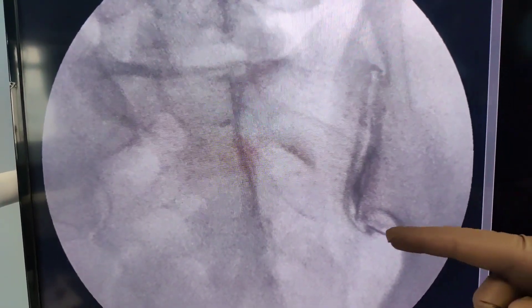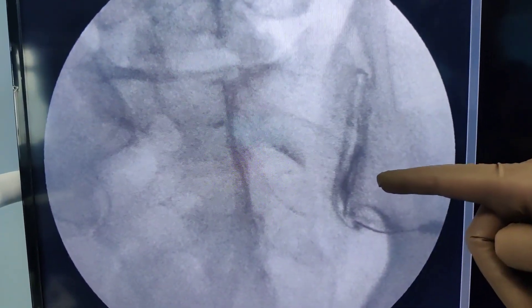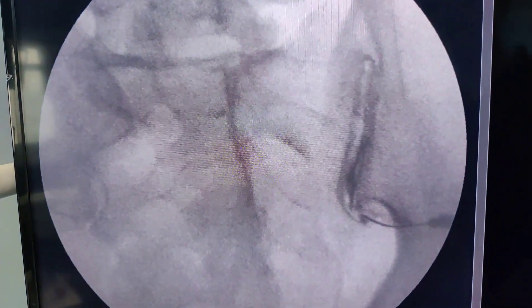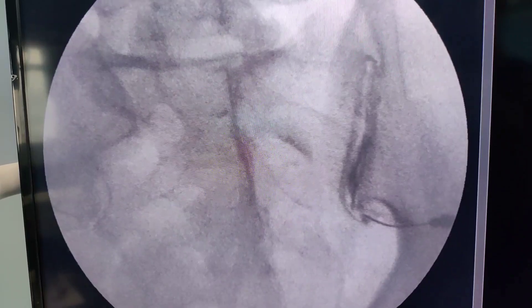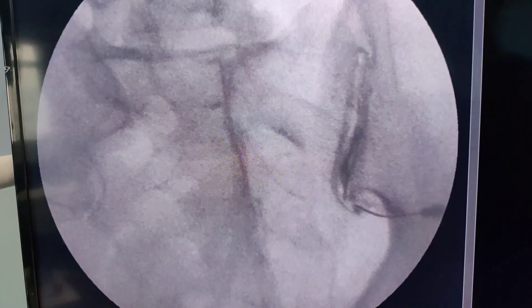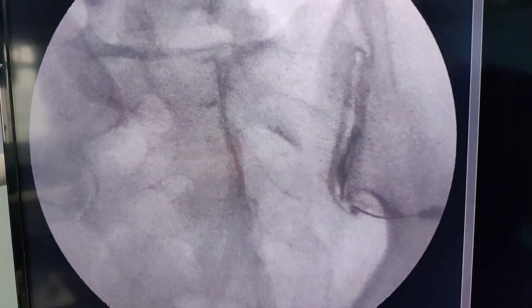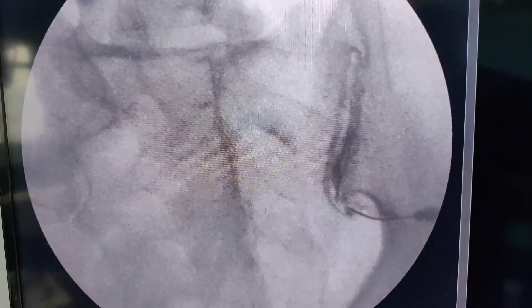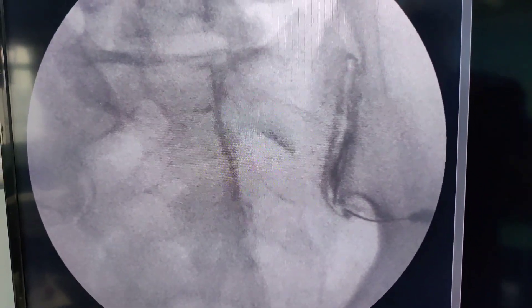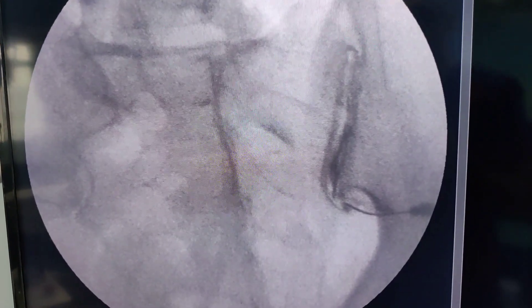In the 15 degree tilted view, the needle position is quite perfect inferiorly and the dye is flowing nicely into the joint. Don't worry if it doesn't look like it's in the joint on the AP view — take a 15 degree view and it will give you a clear indication. In some patients you may get away with zero degrees; in others you may need 15 degrees. On this occasion, the 15 degree tilted view confirms perfect position with beautiful dye flow.